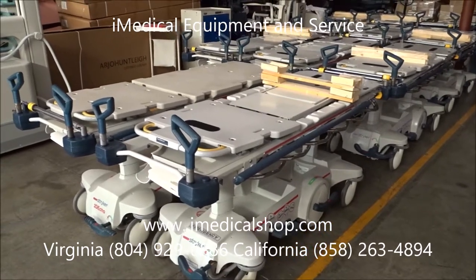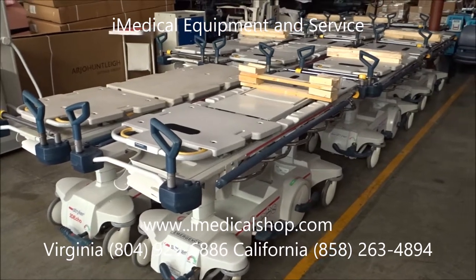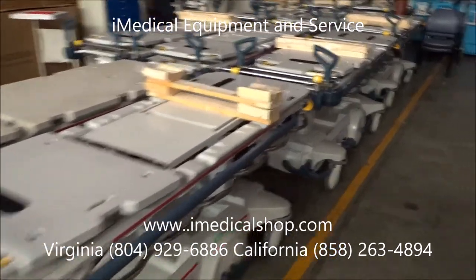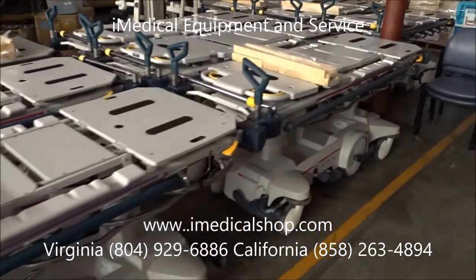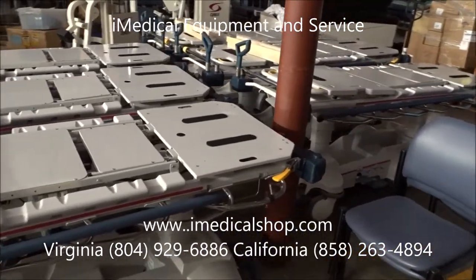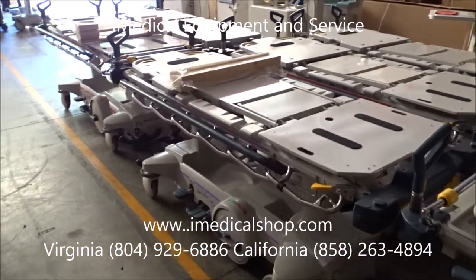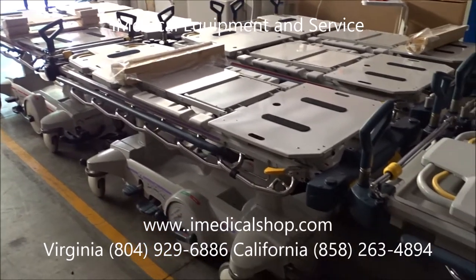We sell a lot of Strykers — the 1005s, the 1015s, and also the 5050s. We sell a lot of Hilrom TranStars as well. The 1005s and 1015s are referred to as the M-Series stretchers. We also have the newest Prime Series stretchers, and we do sell the older models — the Renaissance and other older Stryker versions.